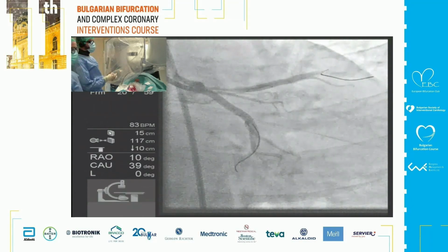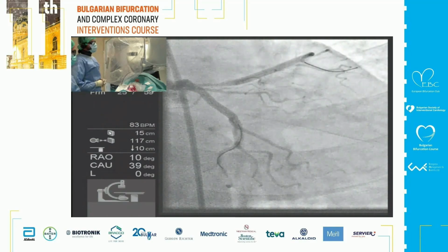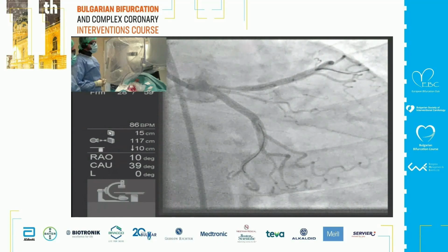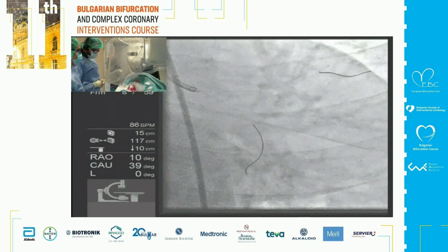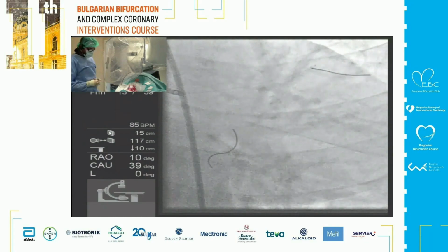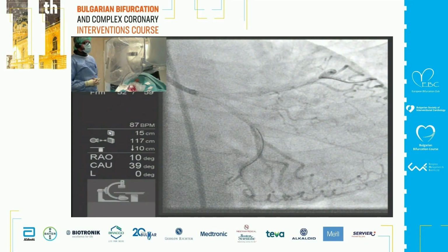I don't know if you have done that, Valery, ever, as an experience. The radial is occluded at the site of the puncture. There are reports on recanalization of the radial through the distal radial, because access is available around the arch. So they recanalize the radials to do radial procedures by access of the distal radial. But I can tell you, echo guided radial puncture is really working well.